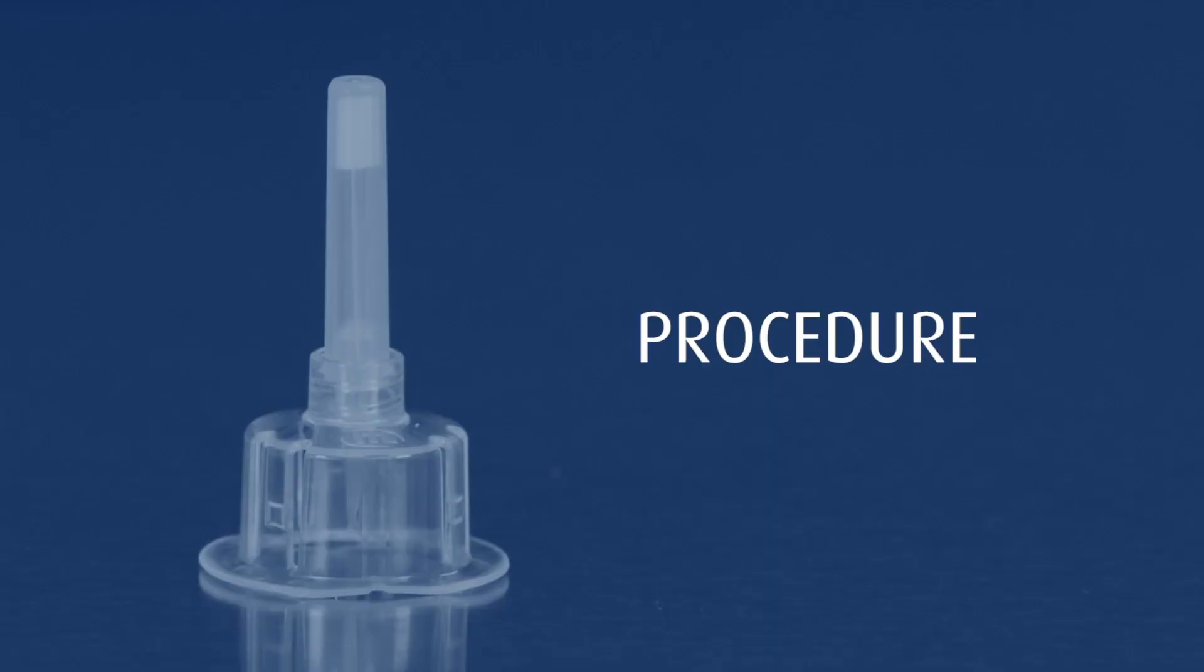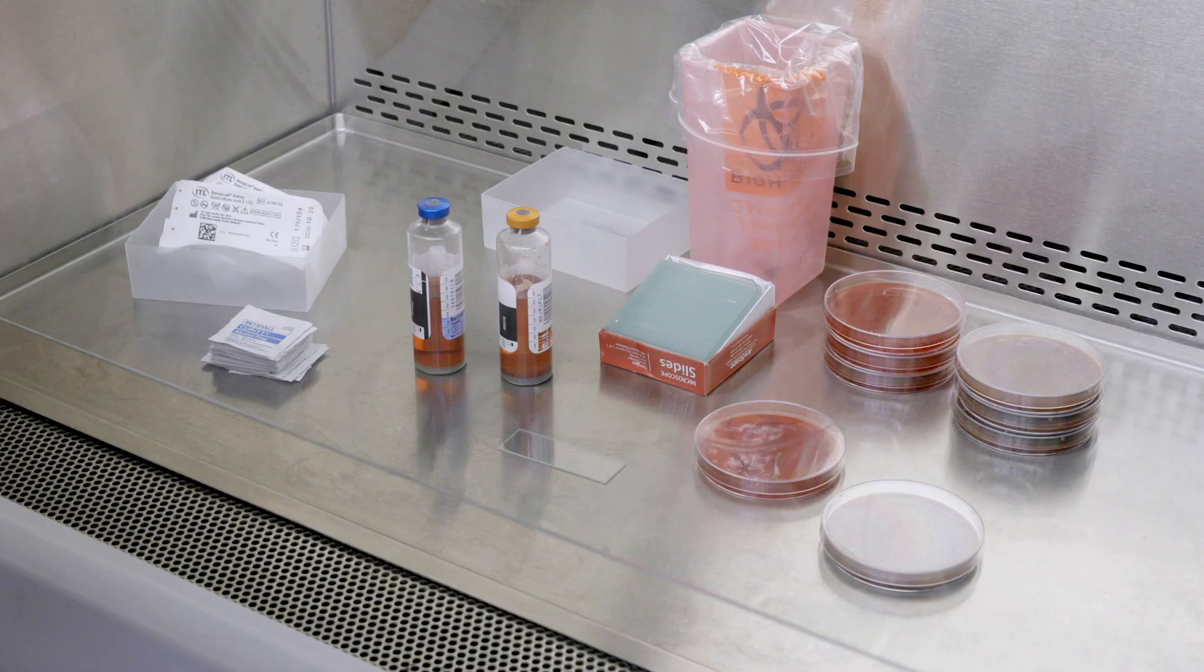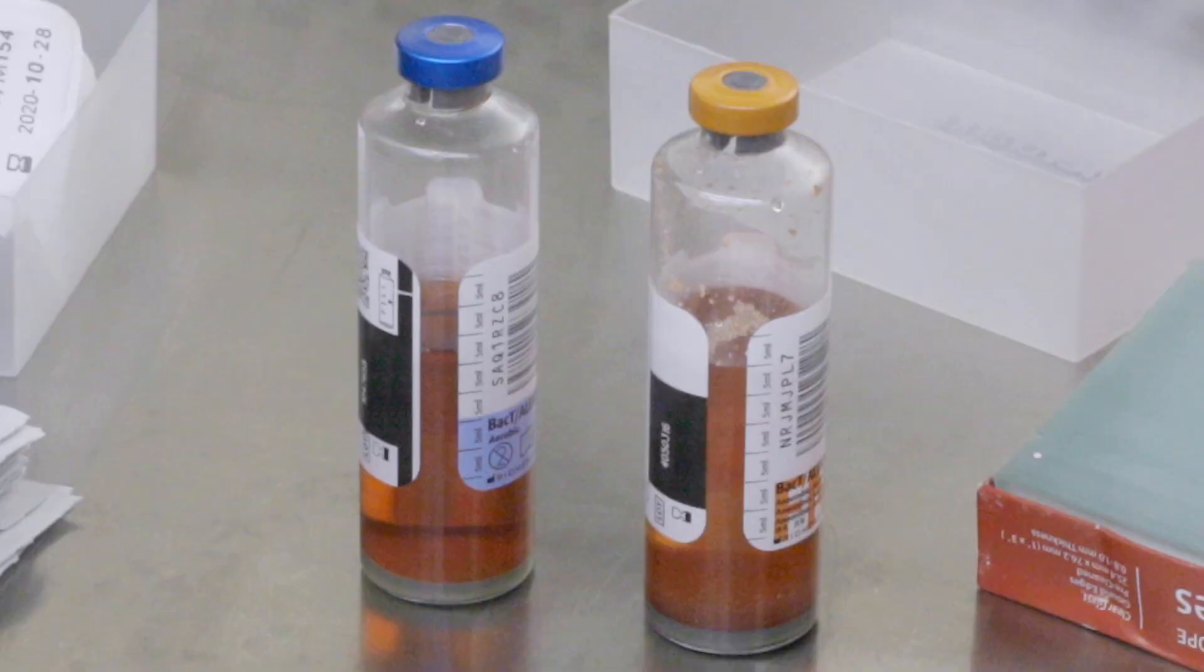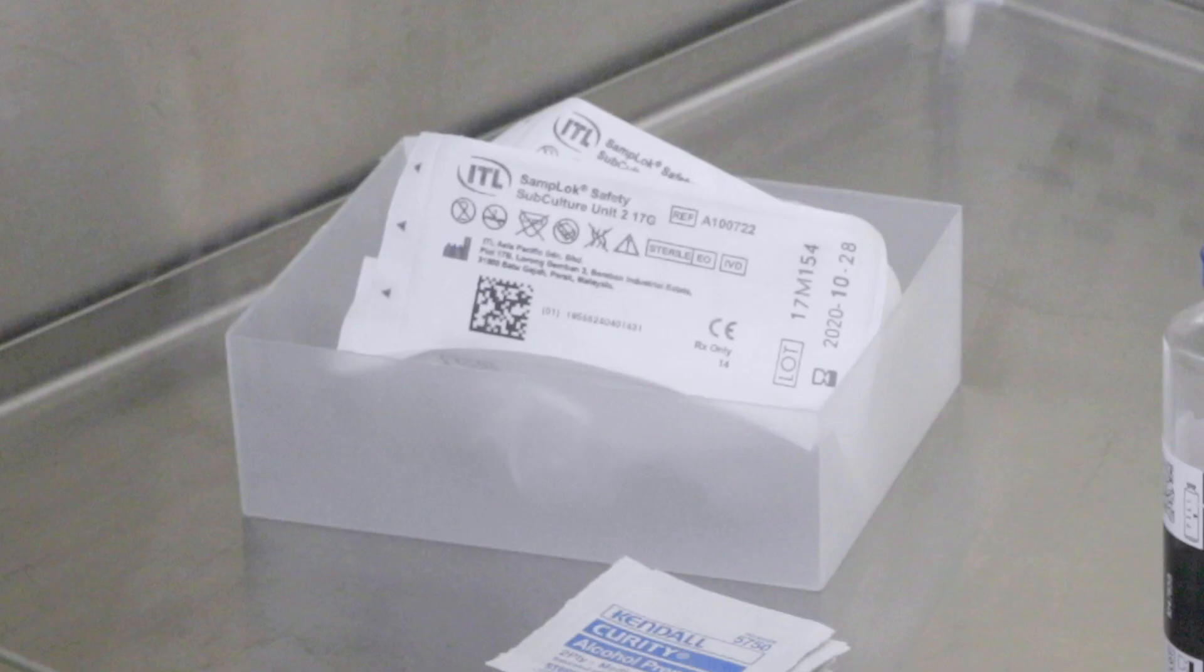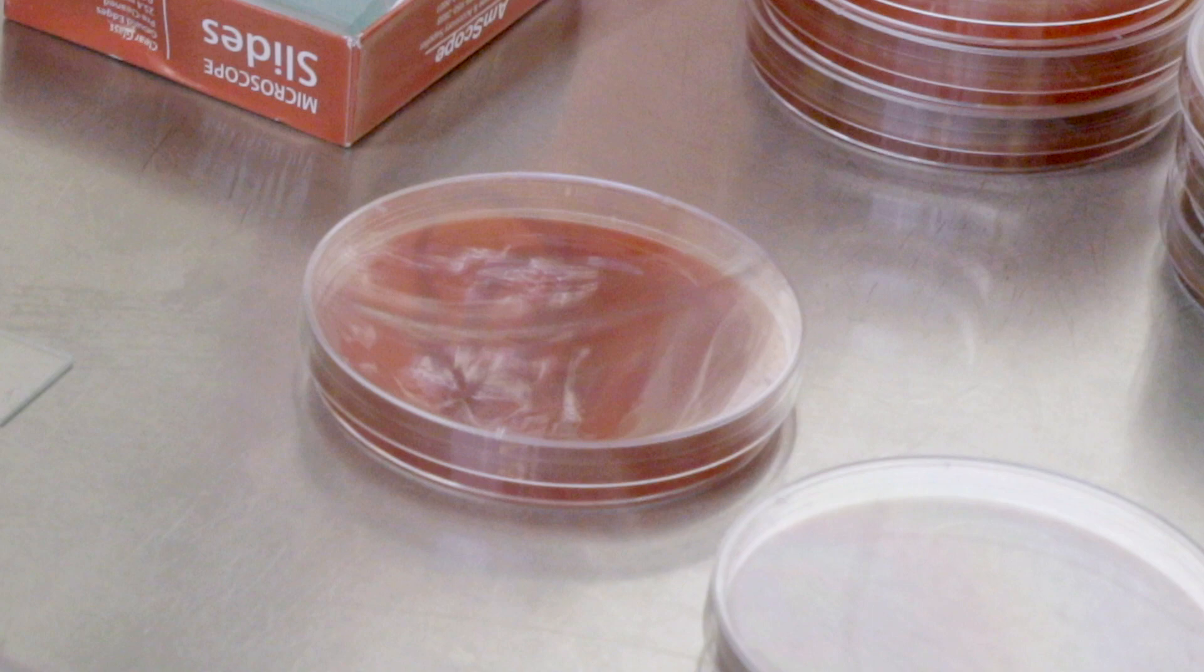Let's review the simple procedure for using Safety Subculture Unit 2. First, gather materials that will be used during this procedure, including blood culture bottles, alcohol pads, SCU-2, slides, and media plates.